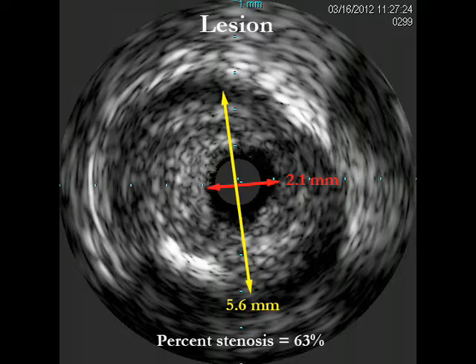Finally, the same lumen and vessel diameter measurements are performed on the proximal reference vessel. In this case, the distal left main coronary artery represents the proximal reference vessel.